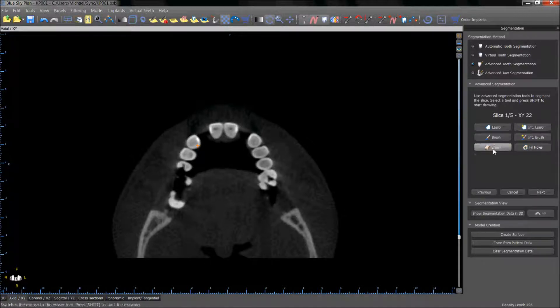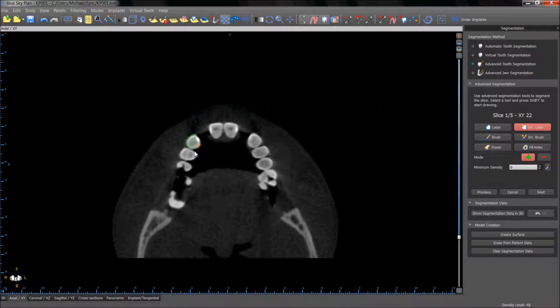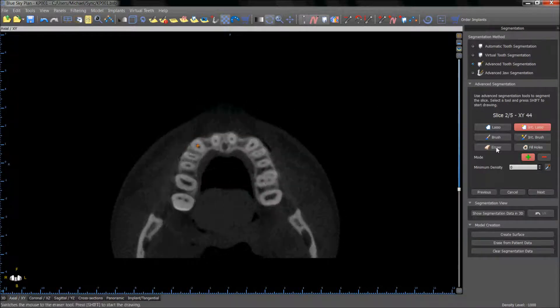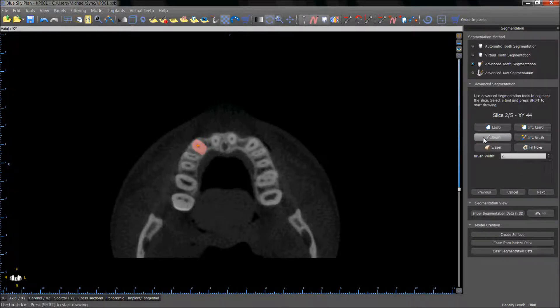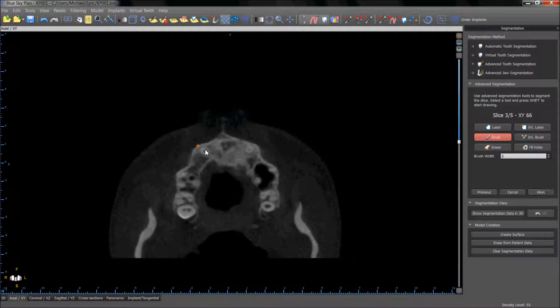Tools such as lasso, brush, and erase can be used to indicate the relevant areas. Intelligent lasso will select the area within the lasso created. Pressing next will take us through a few relevant slices to select the desired area. Tools such as brush can be used to modify the selection of the lasso. The shift key should be held when using any of the tools in the panoramic view.